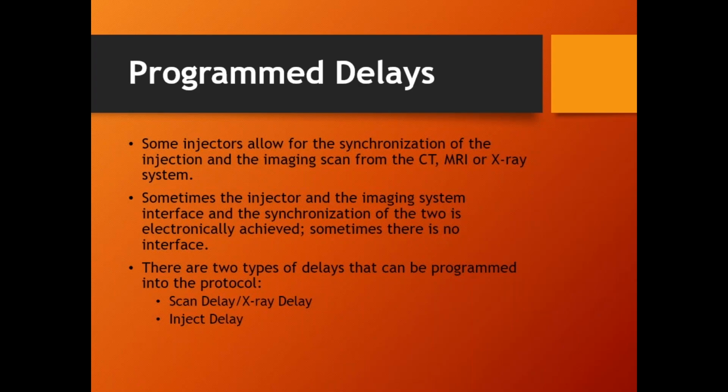All right. Let's say I wanted a 3-second inject delay. All right. So that means I hit. If there were no delays programmed, that means they have to hit the imaging switch. 1 Mississippi, 2 Mississippi, 3 Mississippi. Hit this switch. Okay. That's a 3-second delay.